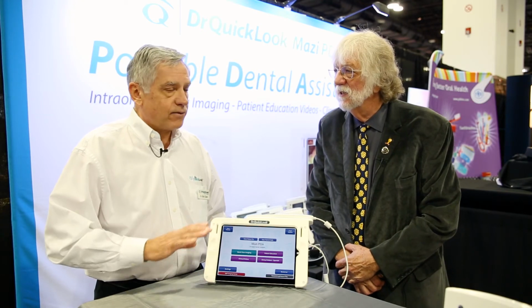Oh, now I can see. You can transfer that. Of course, you can transfer it to that master file I mentioned on your common drive, or you can transfer it to the patient file in your electronic system. Either way. Yeah, either way. But you want to make sure you have them all. And you want to make sure the extras are in the right place, whose pictures are in the right place. Absolutely. That makes a lot of sense. Yep. So this is a lot of stuff. It is a lot of stuff.